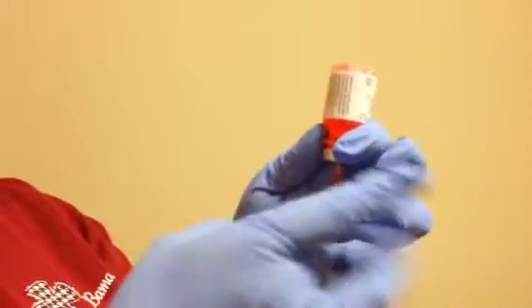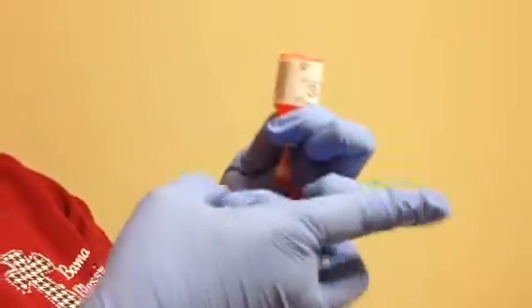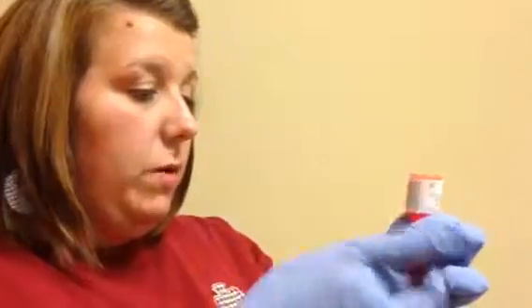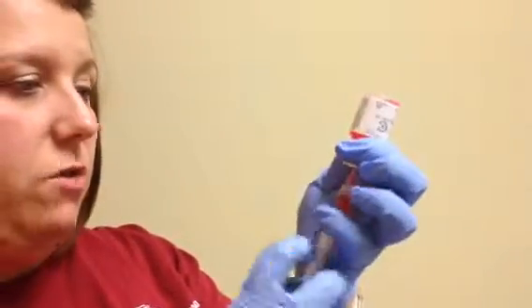I do have a few little air bubbles. Now, air bubbles are a little more important with IV meds. So we want to make sure we get as many of those bubbles out as possible. Sometimes you'll still have little minute ones.